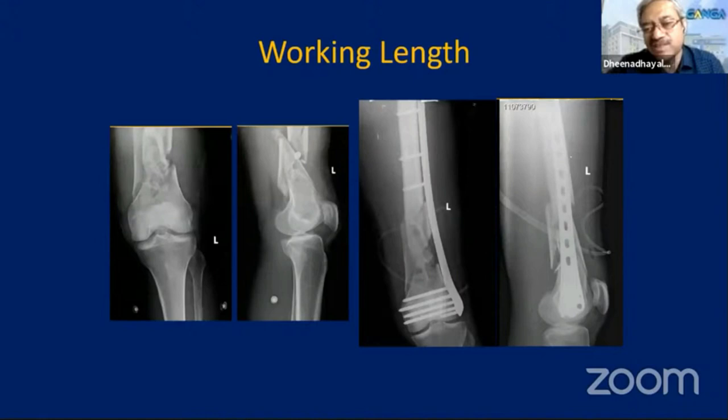Reading Perren's articles carefully, if there is multiple fragmentation, the strain pattern at each fracture fragment is reasonably good enough for fracture healing. On the contrary, if there is a focal defect — only one fragment — then it is a focal defect where there will be excessive stress on the implant, and those are the fractures that will fail. This case has gone on to heal well because multiple fragmentation was present.